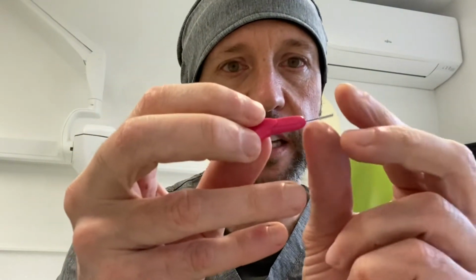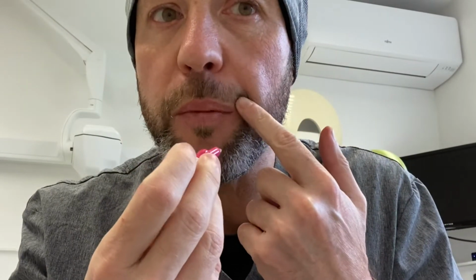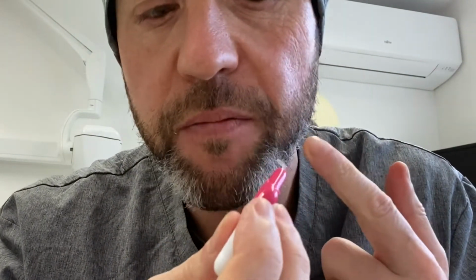And now I've demonstrated on the front one there so you can see, and that's a really easy place to brush. But sometimes it gets harder as we get to the back teeth, okay? Things you can do for the back teeth to make it easier is you can get your brush like this, you can bend it like so, and you can make it a little bit curved like that. So when it's curved like that, then you can go through, position it in between the teeth and go through like so. I'll show you now on one of my premolars if you can see okay.